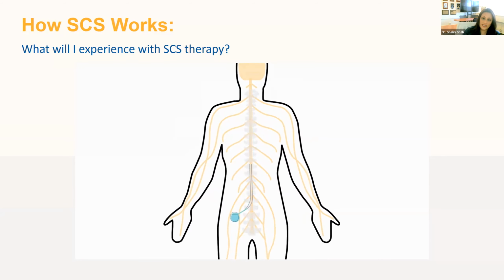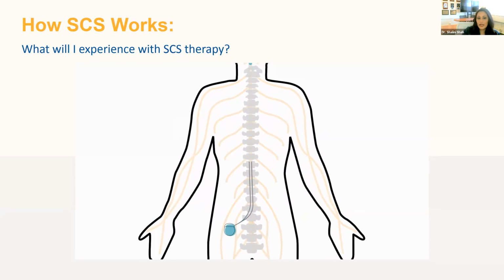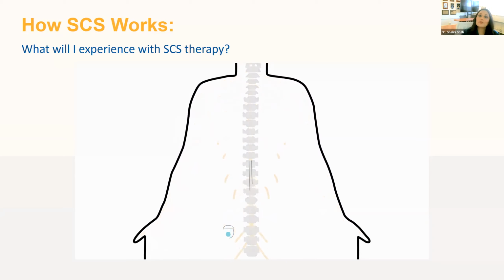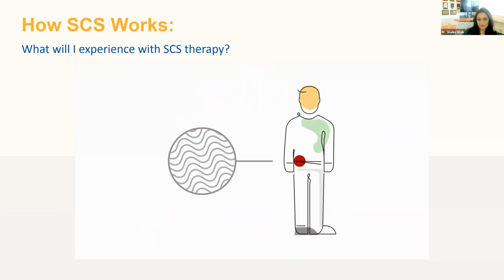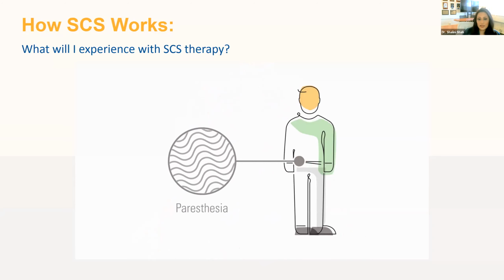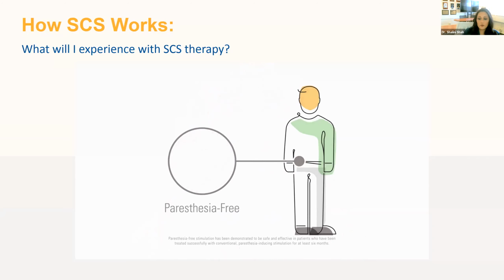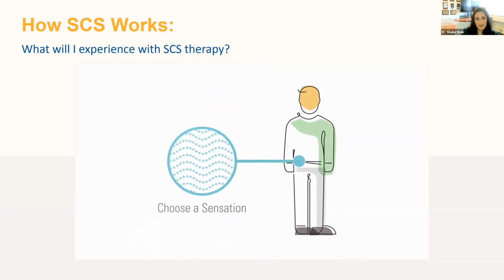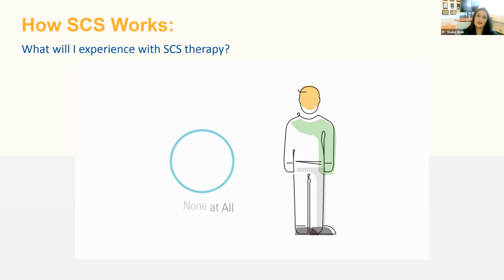And these batteries are so sophisticated now, they're so thin, to block the pain signals using that gate theory that we talked about. Okay, so you can see the pain signals may still be coming, but now they're blocked with the electrodes. This is a gentleman with arm pain. He has the spinal cord stimulator over him, and it gives a paresthesia sensation. Paresthesia is another word for the TENS device that you feel, that vibration. So the vibration pretty much maps over the area with his pain. So he may feel some mild vibratory signals, but he's not feeling the pain.